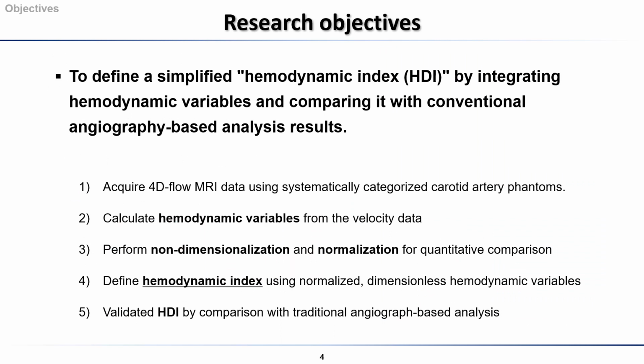So we set our research objective as to define a simplified hemodynamic index by integrating hemodynamic variables and comparing it with the conventional angiography-based analysis method. To achieve this objective, the following process was carried out.